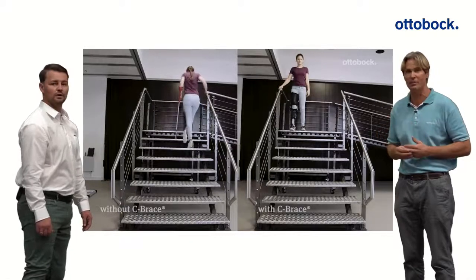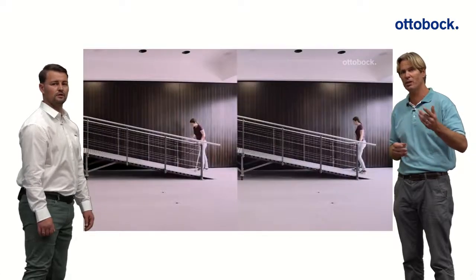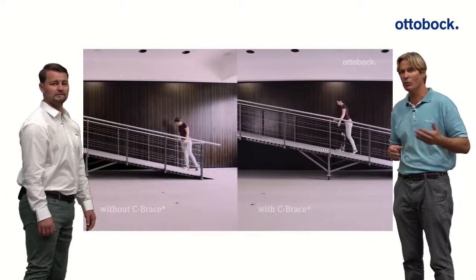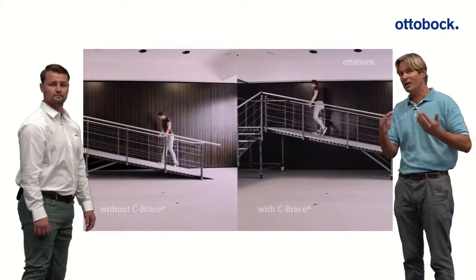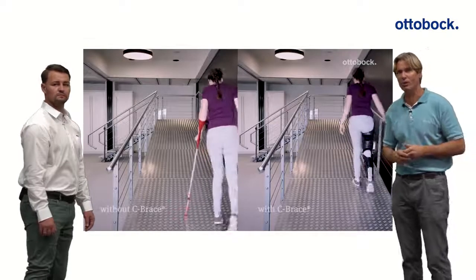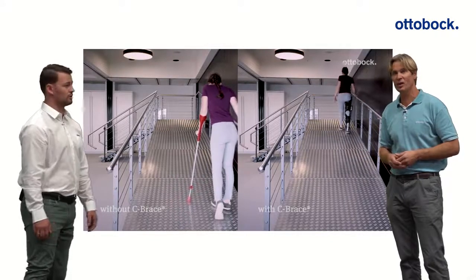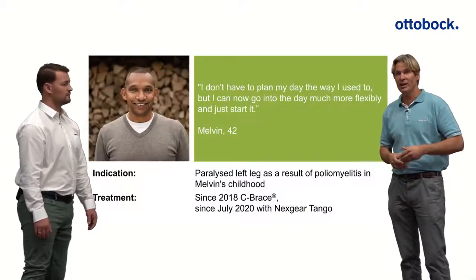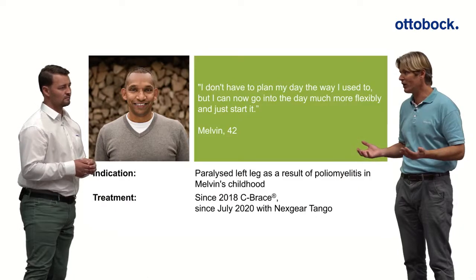On the ramp, without the brace she's really struggling — it's almost impossible. But with the C-Brace and Tango joint, she can manage that steep ramp step-over-step. She enjoys it and the gait is really clean. We still recommend holding on to the handrail for safety reasons.